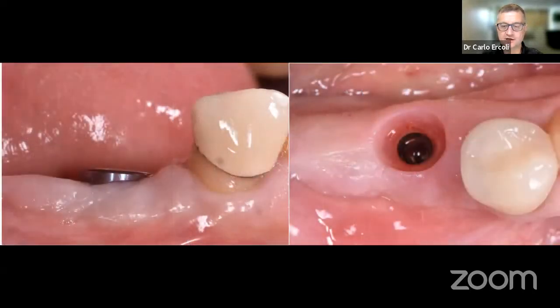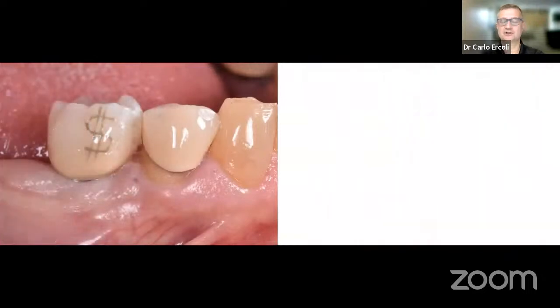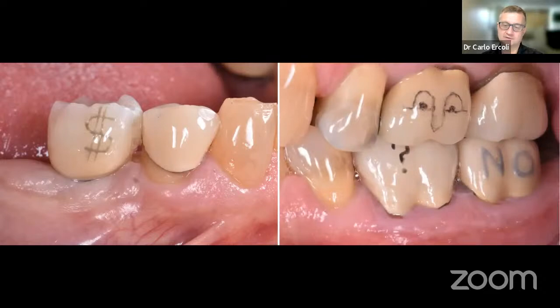Here, a little joke. This is a patient of mine that I have done exactly that type of xenograft, soft tissue xenograft placement. But you might see that this patient had additional requests. And one of the requests in the crowns is that each crown be characterized.